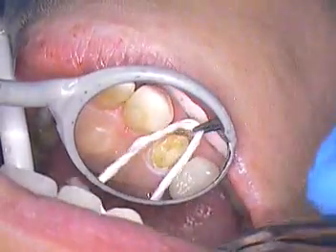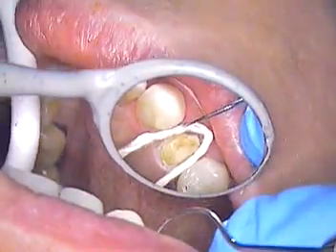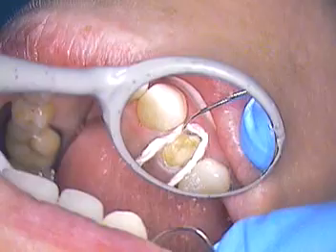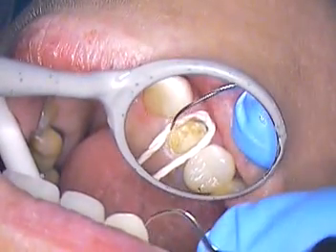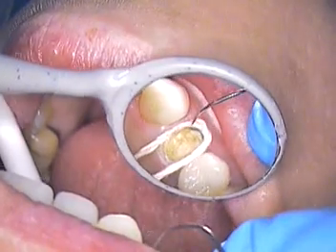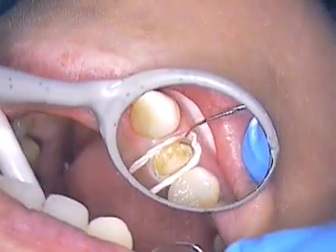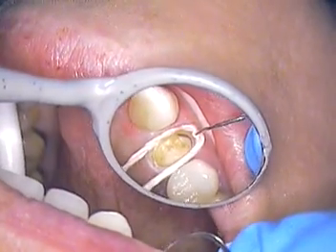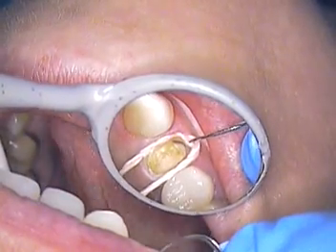We're going to place the next retraction cord. This is our Gingi-Pak cord and we're just going to tuck that in just under the tissue.